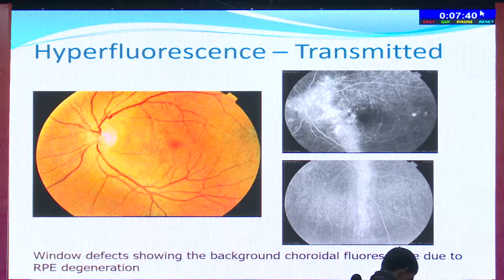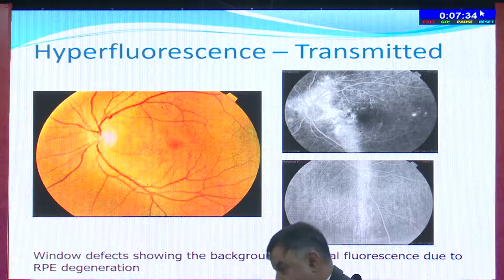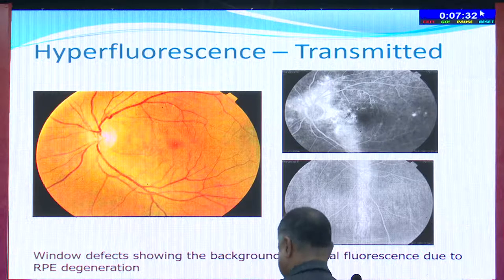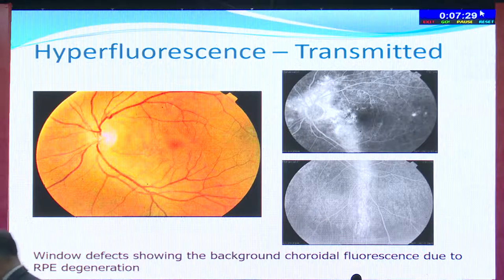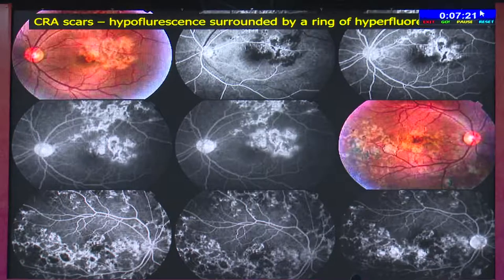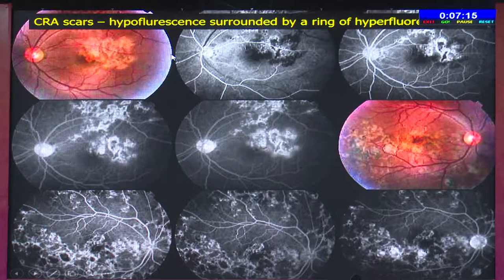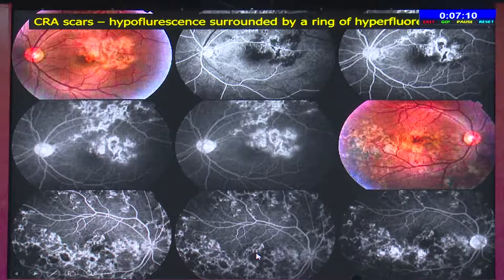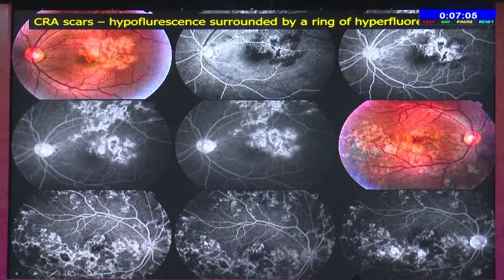Transmitted hyperfluorescence results from retinal pigment epithelial atrophy highlighting the underlying choroidal flush. Window defects showing the background choroidal fluorescence are known as transmitted hyperfluorescence. As seen here, you can see areas of chorioretinal atrophy. Where there is a pigment clump, you see hypofluorescence due to blocked fluorescence, and the hyperfluorescent areas at the margins are where there is an absence of retinal pigment epithelium highlighting the background choroidal flush.